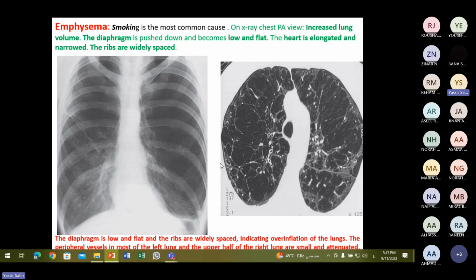في حاجة اسمها البولي اللي هي pocket اللي هو أصلا هي الانفيزيما بيحصل destruction of the wall of the alveoli. بيحصل escaping of the air تعمل لنا pocket of air collection. فدي بسموها البولي. بس this بولي can be seen on the chest X-ray زي دي مثلا. يعني بتلقى إنه عندك زي wall كده والمنطقة هايبرلوسد.